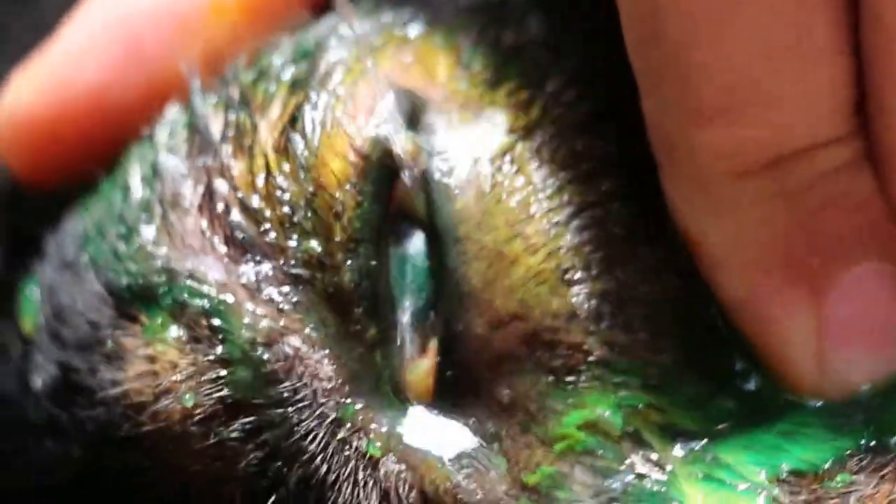Okay, now you can see that. Okay, a bit green. Just lightly open the eye. Maybe he knows the ear. No, never mind, sorry.